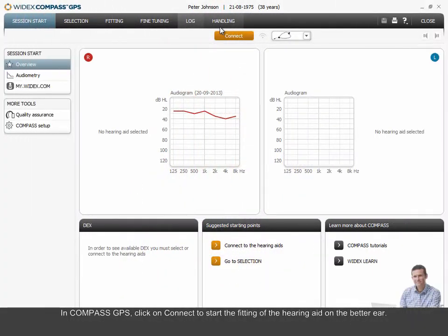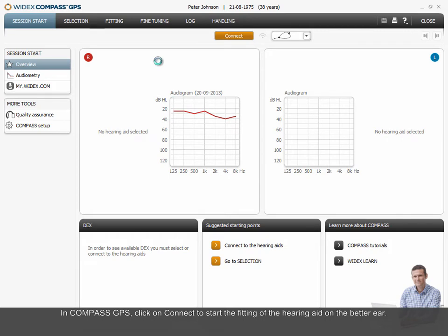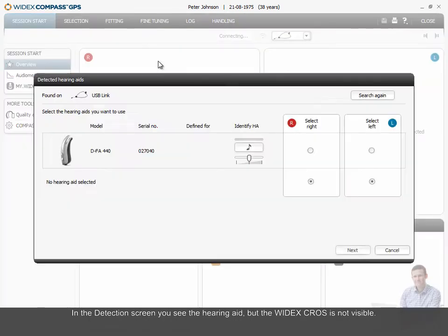In Compass GPS, click on Connect to start the fitting of the hearing aid on the better ear. In the detection screen, you see the hearing aid, but the Widex CROS is not visible.